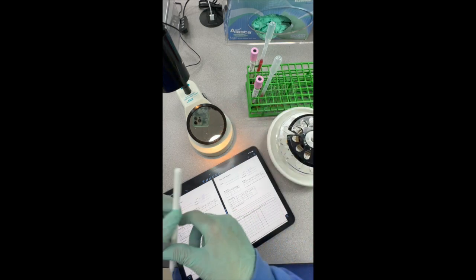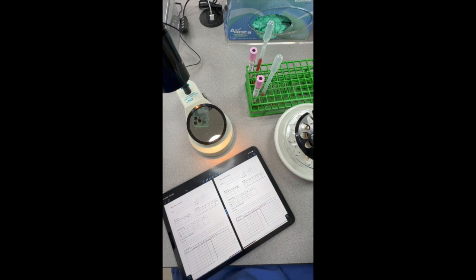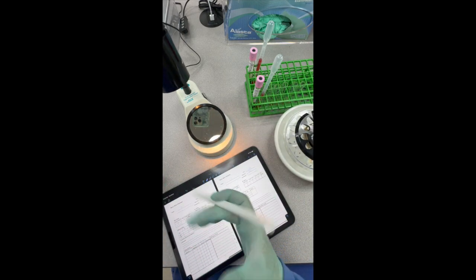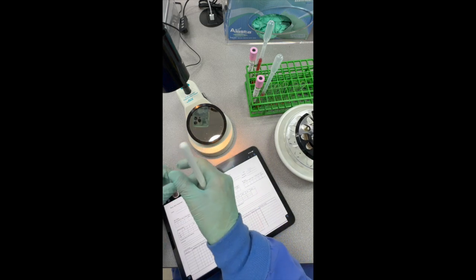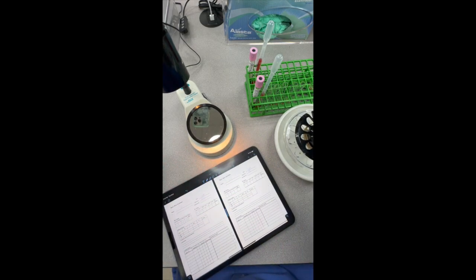Again, negative. Put that. We'll move on to our back type. And very nice 4+ reaction there. Okay. 4+. And another, which is what we would expect. Another 4+ reaction. Okay. So we'll put that there.